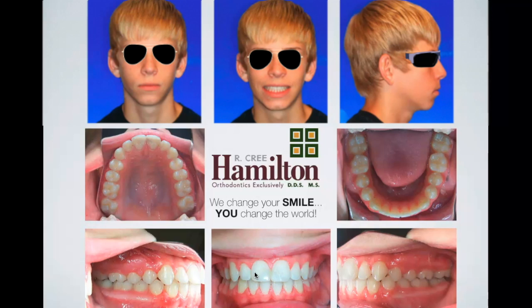Uh-huh. So basically, make sure that you have room between the roots, right? If you need to upright the roots first, then do that. Sometimes you'll have to perform a frenectomy, depending on where the frenum is. You basically pull the lip up, and you put the TAD as high up as you can, where the patient can still keep it cleansable. And then what I do is I run a T slot on the wire itself. If you look on Pearl's Facebook, I showed a case there that shows the exact mechanics, and they referenced an article, which I was unaware of, that did something similar.